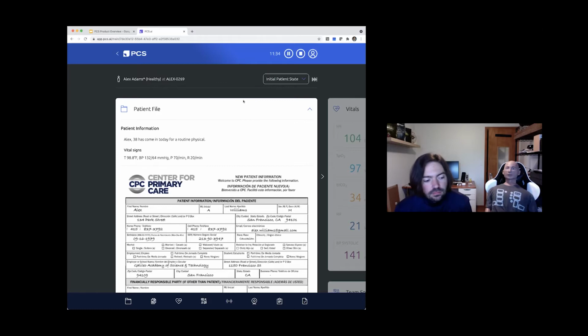Can we create new drugs? So there is a predetermined list of drugs that are built into that modeled physiology framework. If there is a drug that you think should be added that isn't available, we're certainly open to looking into potentially adding that to the list. But it's not possible for end users to go in and add their own drugs to the list. And it would be a fairly complicated process if that was possible. But that is something that we control on our end.